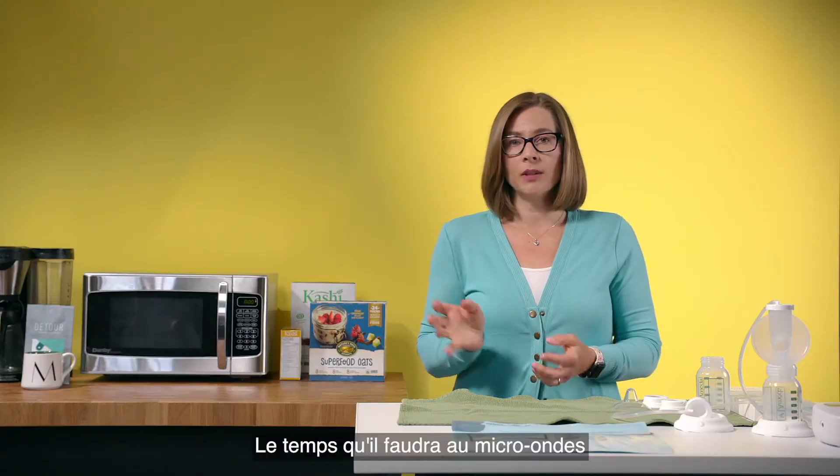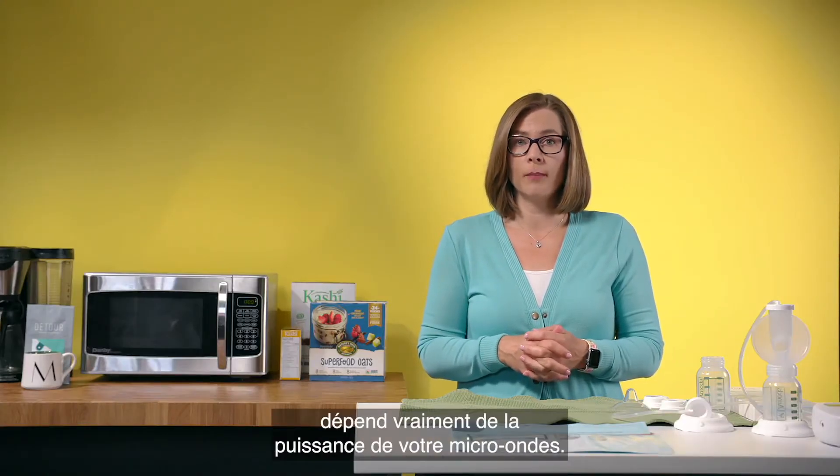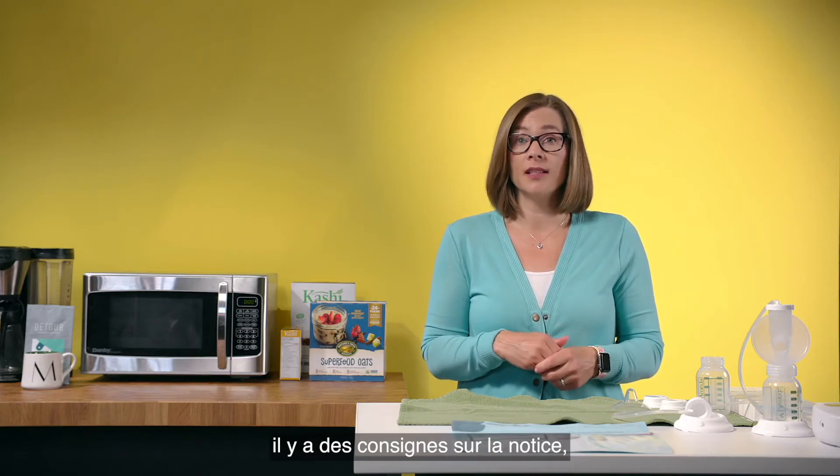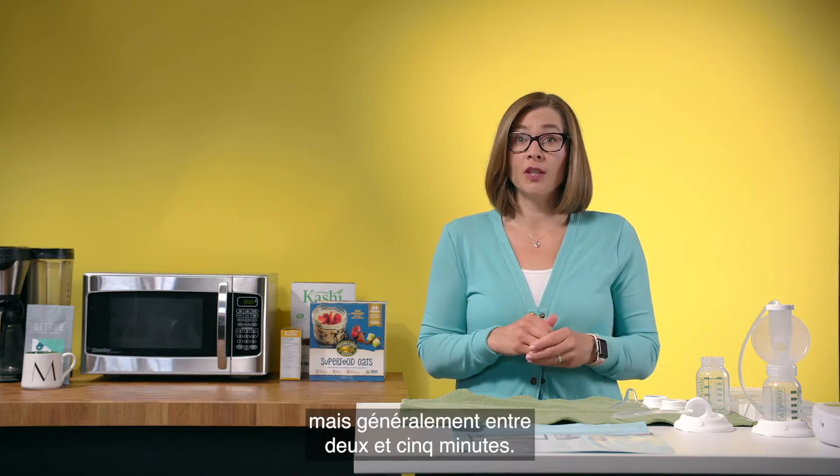The time that it will take in the microwave is really dependent on the wattage of your microwave, so the more powerful the microwave the less time it will take. There are guidelines on the instructions but generally between two and five minutes.